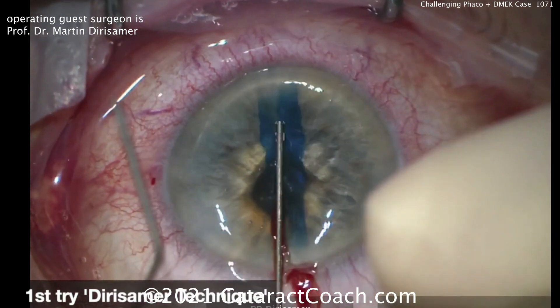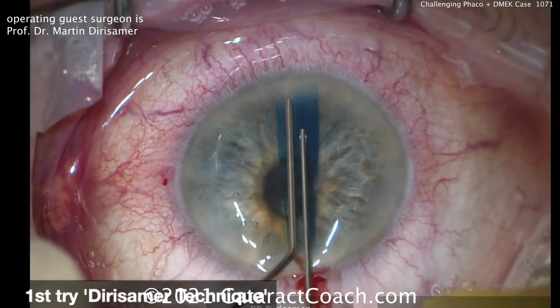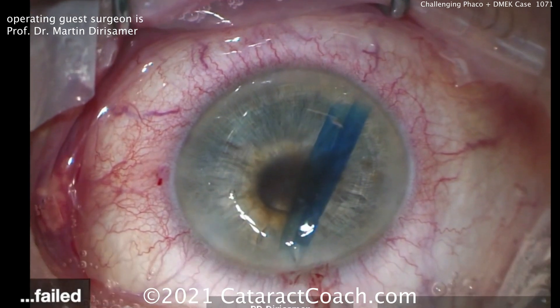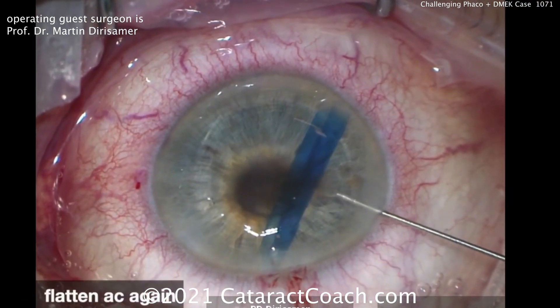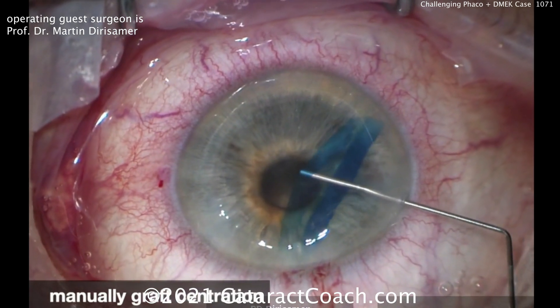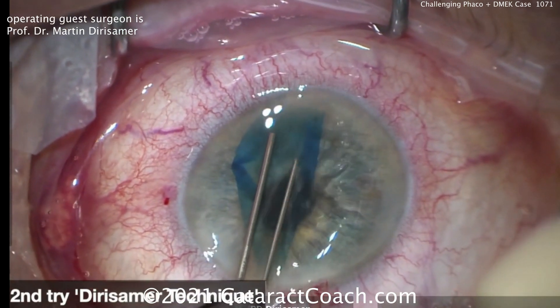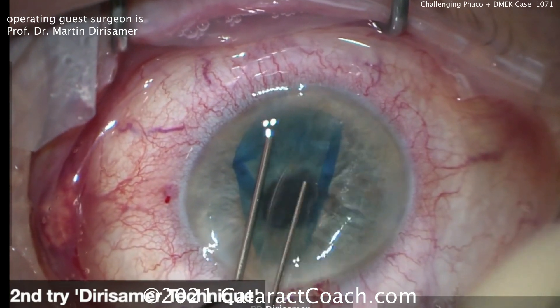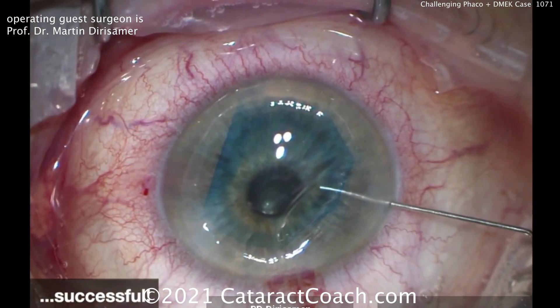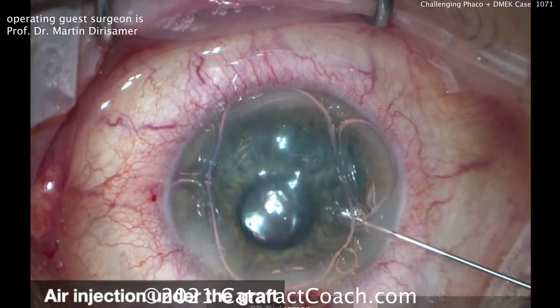Here's the Derisamer technique using two 27-gauge cannulas, trying to tap the center and get the graft unrolled. It's getting a little progress but not enough, so the next move is to flatten the anterior chamber even more — aspirate fluid out directly, really get the AC flat — and then manually push the graft over. He's not touching the central endothelial layer, just touching out in the periphery, a very safe technique. Now the graft is in pretty good position, nicely centered, and here comes the air bubble to push it into position.